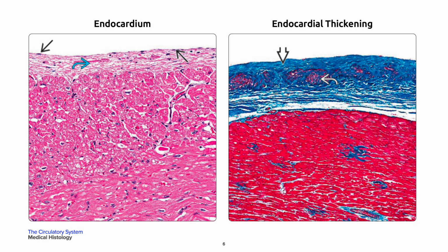On your left is a ventricular endocardium, which is comprised of a single layer of endothelial cells in a single black arrow with flattened inconspicuous nuclei and varying amounts of subendocardial connective tissue in a curved blue arrow. These are found on the ventricular luminal surface.